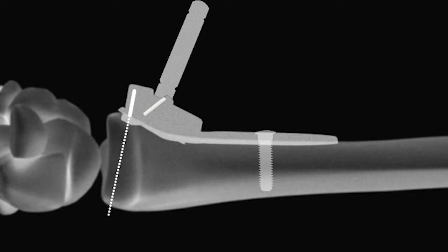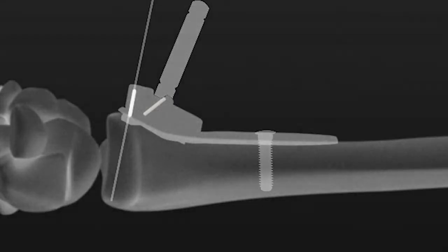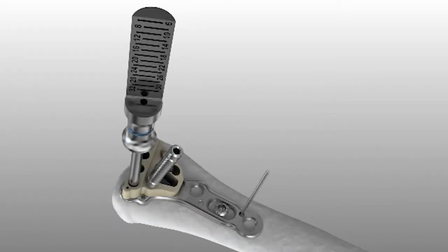To further assess the position of the distal 2.3 mm screws relative to the radiocarpal articular surface, place an .054 K-wire through one of the K-wire holes in the targeting guide closest to the joint and assess its location under fluoroscopy. Insert the drill guide into one of the distal screw holes, followed by the 2.0 mm drill.